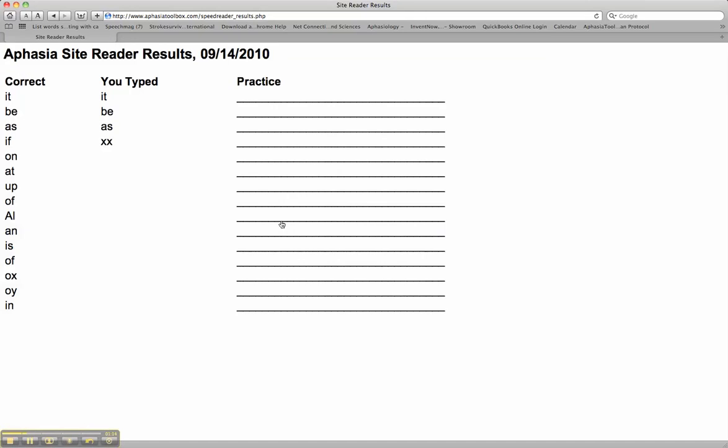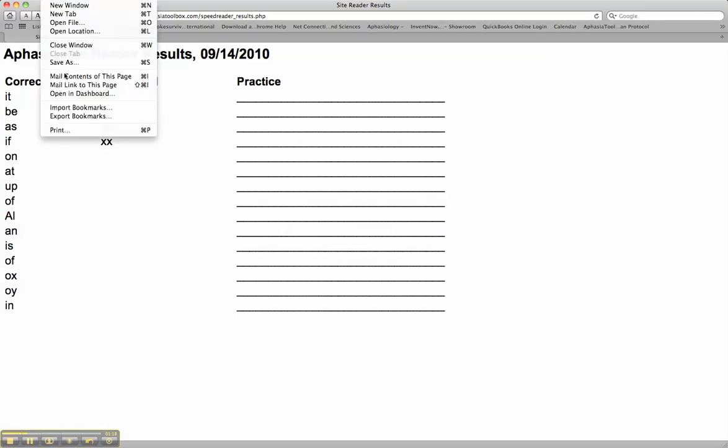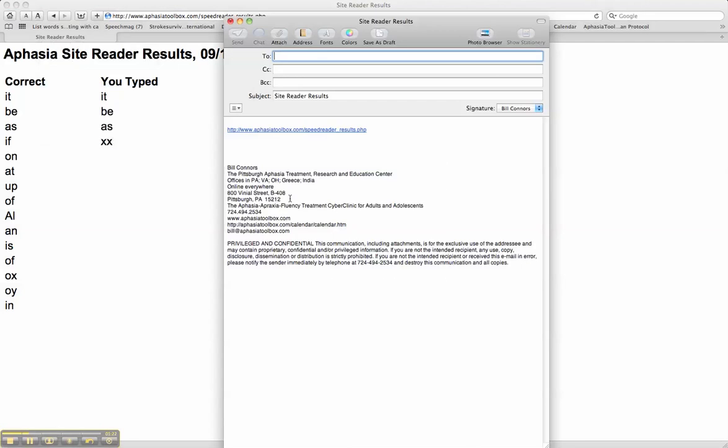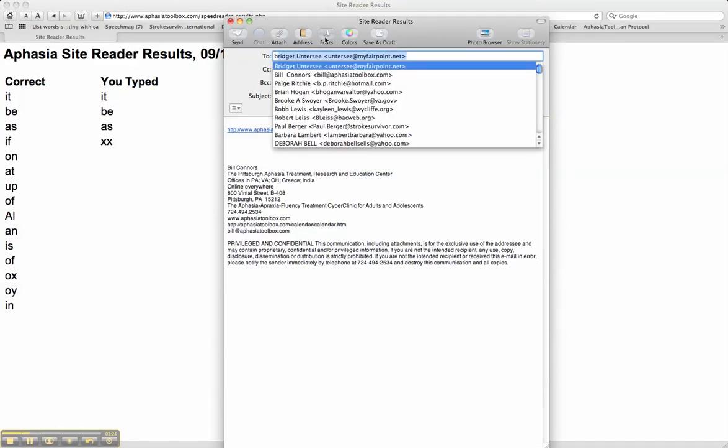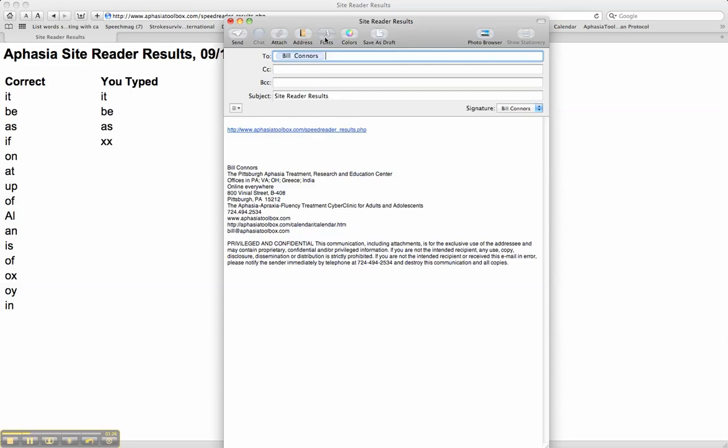This can be saved for a paper trail for documentation purposes. This can also be emailed to you at your office so that you can follow the patient's progress.